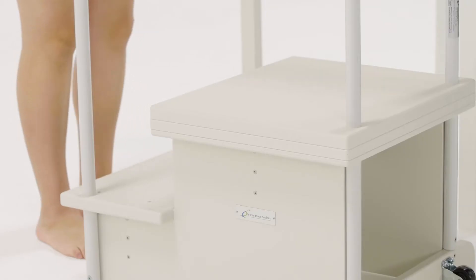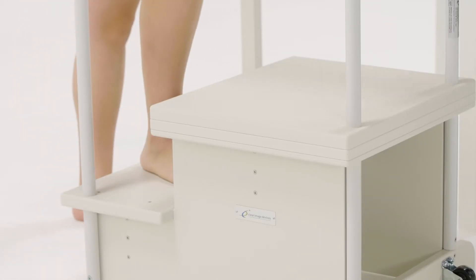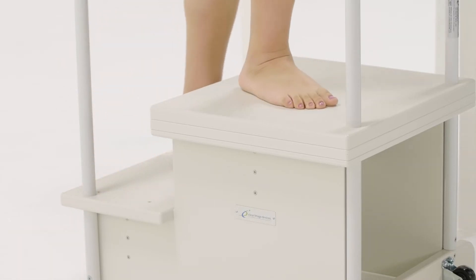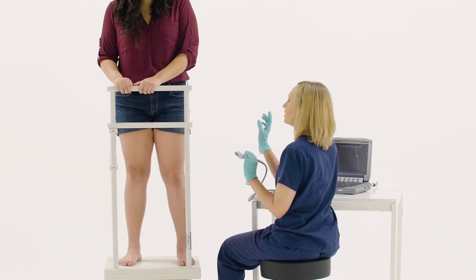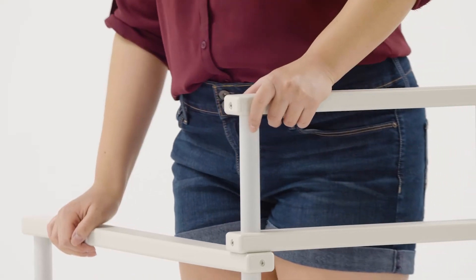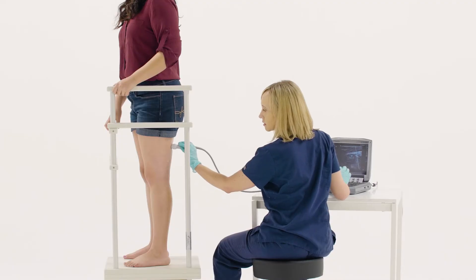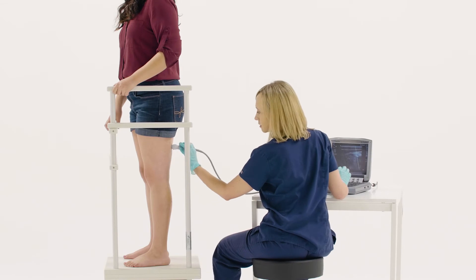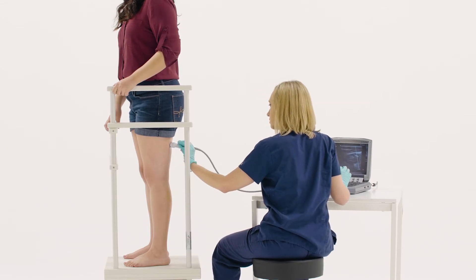Our ergonomic design elevates patients off the ground during standing leg venous insufficiency studies. With two built-in steps, patients can easily be positioned and side railings provide stability during the ultrasound exam. The added height allows sonographers to comfortably sit next to the patient throughout the duration of the exam without having to bend over.